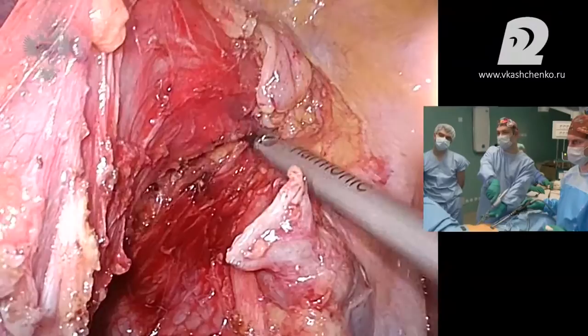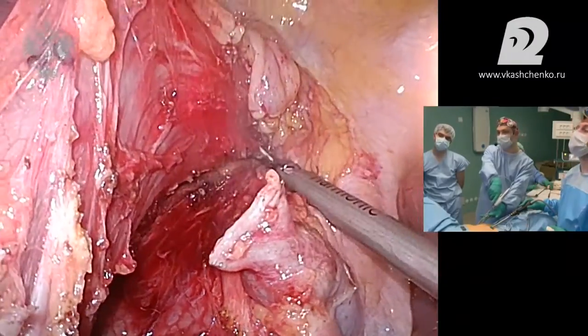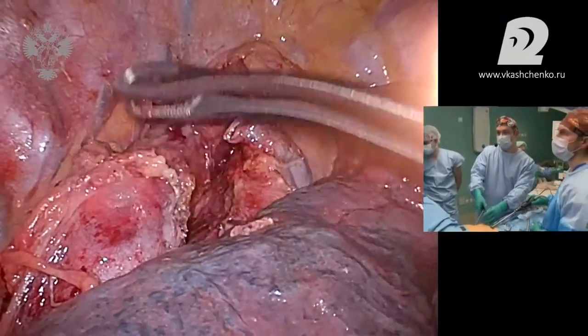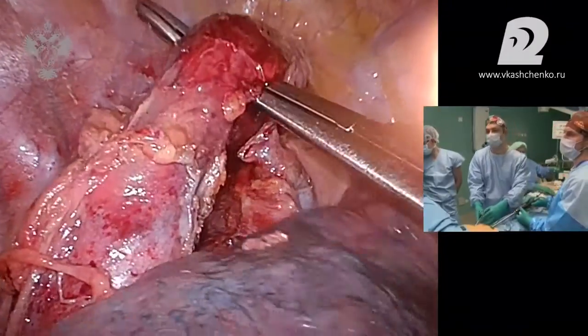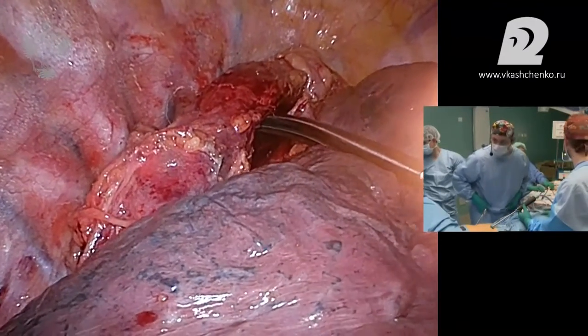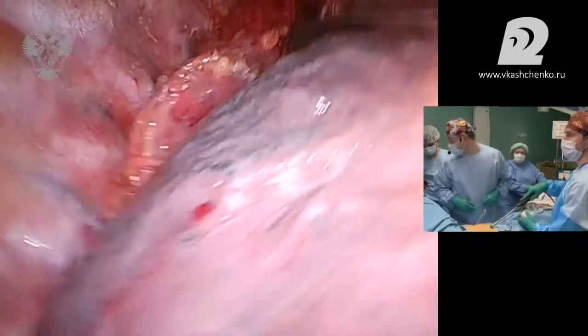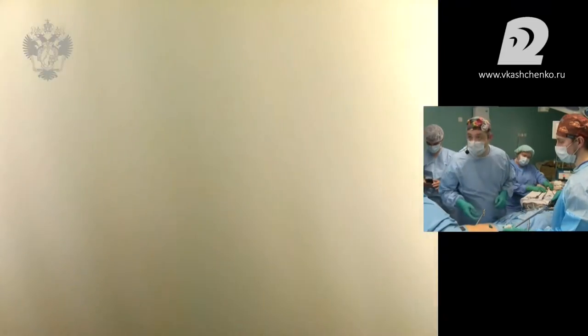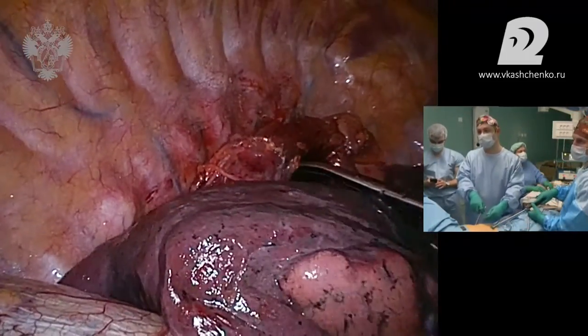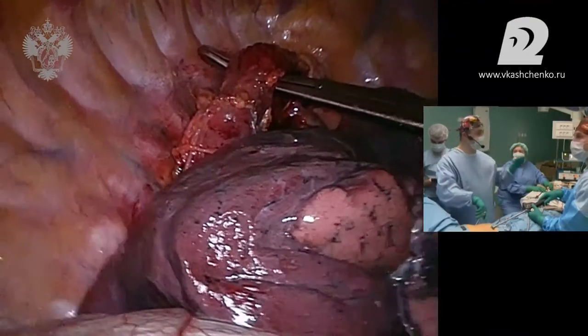Да. Хорошо. Назад. Назад. Так. Ну и все, собственно, мы вот. Мы можем сейчас взять и пойти вниз. Где у нас Дмитрий Анатольевич? Надо позвать его. Ему сейчас надо будет подтянуть зонд из желудка. Иванович, приготовьте мне... Сейчас попробуем его найти. НДЖ фиолетовый. Не надо искать. Я говорил про нашего анестезиолога, про Дмитрия Анатольевича, не про Виктора Анатольевича, не переживайте. Понял. Есть фиолетовый у Инны, да.